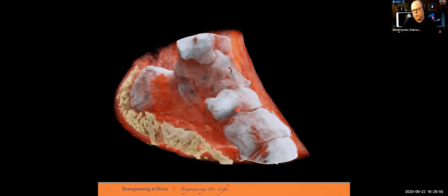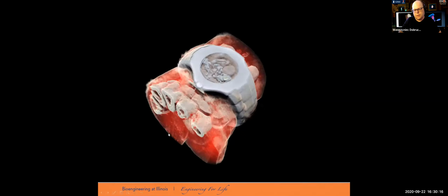Of course, we can differentiate the bone from the tissue, but definitely not the types of tissues. These are two different types of tissues. I don't remember if this was fat and this was muscle, but using this MEDIPIX technology or multispectral imaging, it is possible to differentiate those using a single scan.